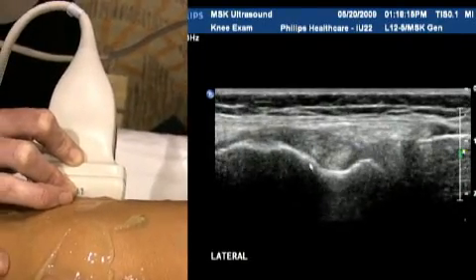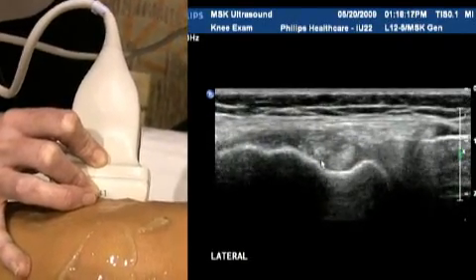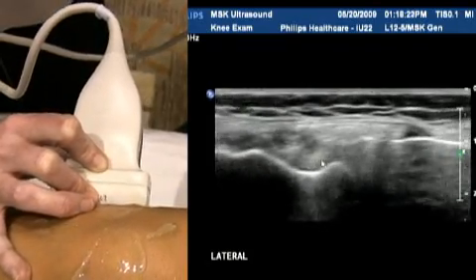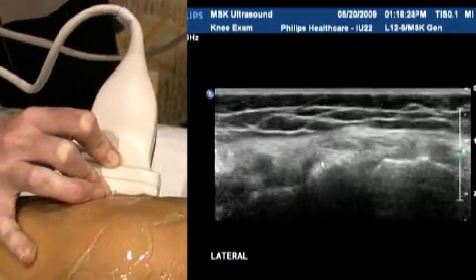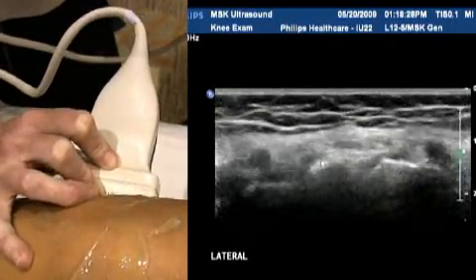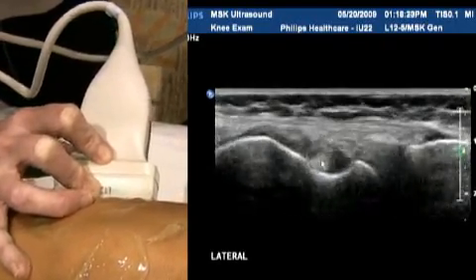You can see the popliteus tendon down here — quite round, quite echogenic, and quite normal looking in this patient. And again I'm just assessing generally for fluid extending out of that joint.